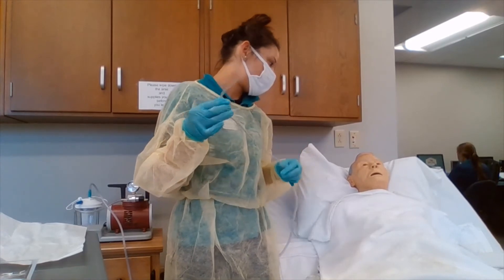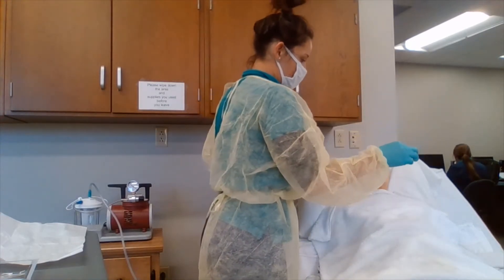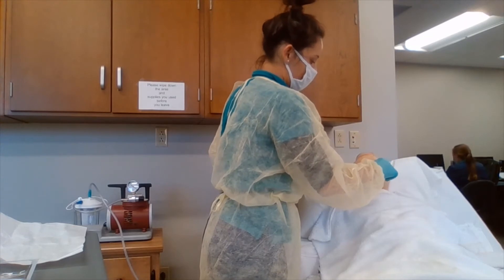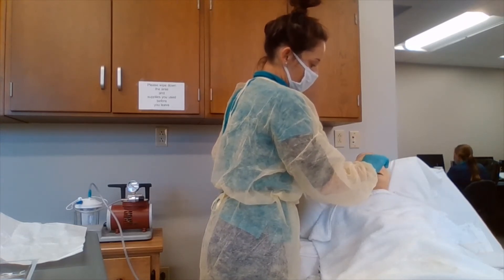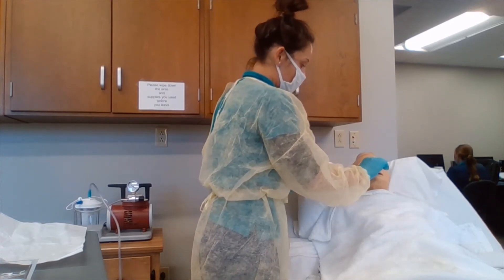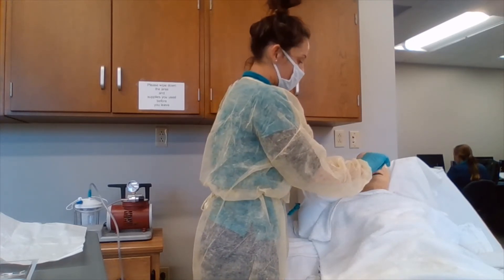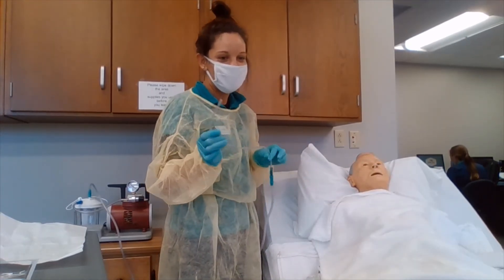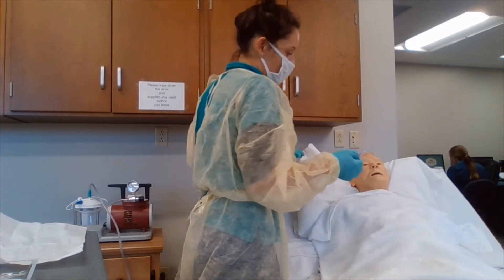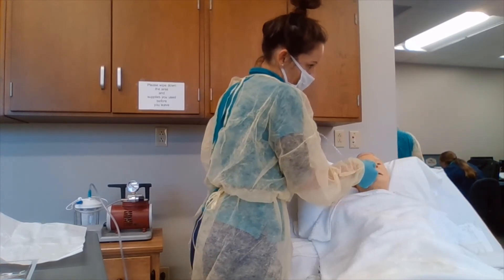For oropharyngeal suctioning, we are going to be inserting the tubing at the patient's side of the mouth and slipping it in until we reach the oropharyngeal area, making sure we are not forcing it. We go to the depth of the pre-measured measurement, which would be approximately three to four inches. For nasopharyngeal suctioning, we lubricate with a water-soluble lubricant and insert into the nares to the pre-determined measurement of five to six inches. If we meet resistance, we try the other nares.